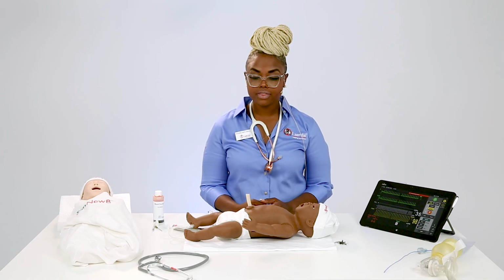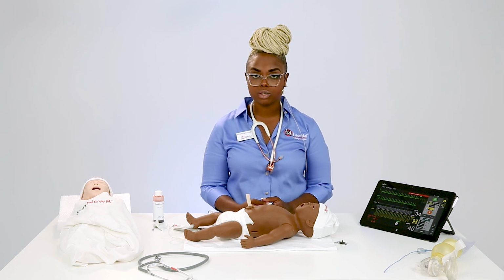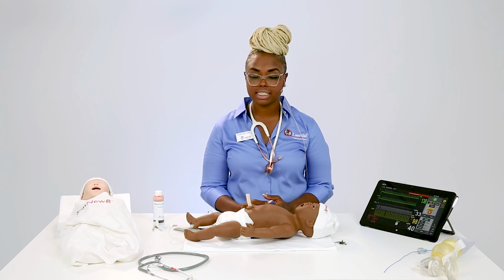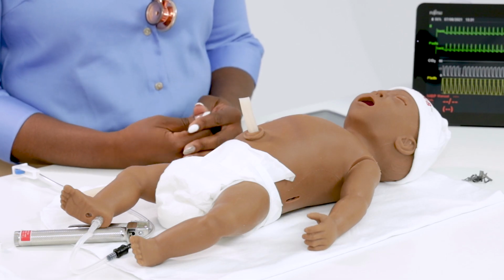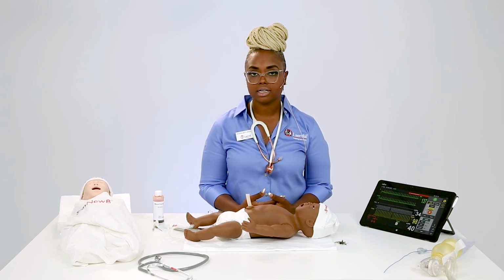Great, thanks, Rotara. Next question I see in is, how does the simulator get serviced or updated? Great question. So with the updates, you can go to Laerdal.com, product downloads, and download those updates, or you can get on the phone with tech support for assistance. They're open 6 days a week. As far as servicing, there are a multitude of service programs that are compatible with your simulator.